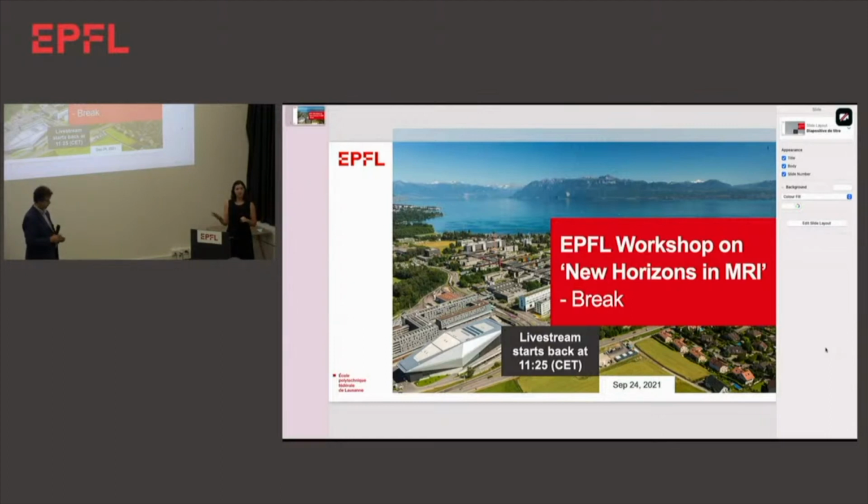I do think there are a couple of dynamic range issues, and some of them are physics based and some of them are how we do our analysis, but we have to keep track of all of those things in order to make sure that we're not forcing ourselves to get measurements. You're going to get an answer with fingerprinting, it's just whether it's the right answer or not. And this is why we test in phantoms and simulations and in vivo when we can, in order to make sure we're not doing that.